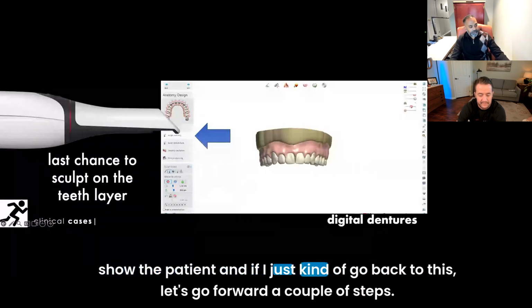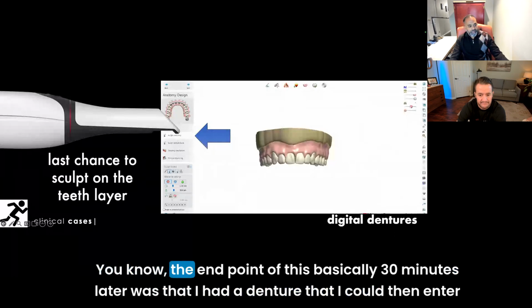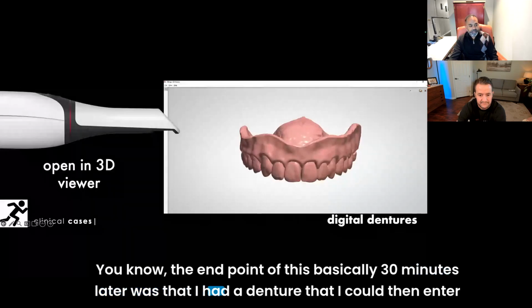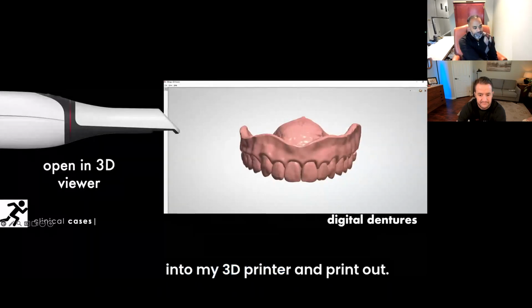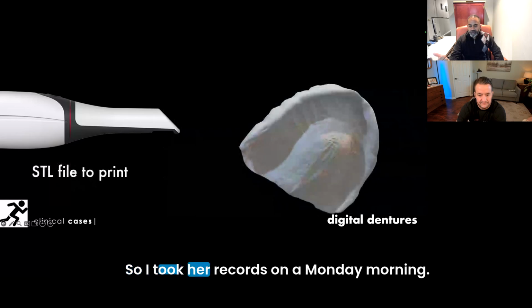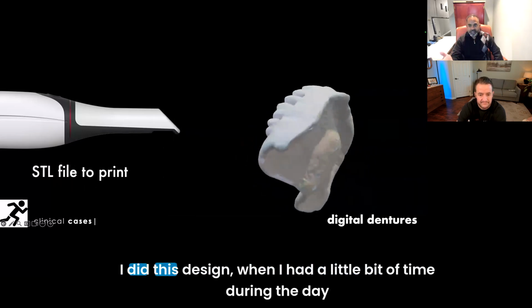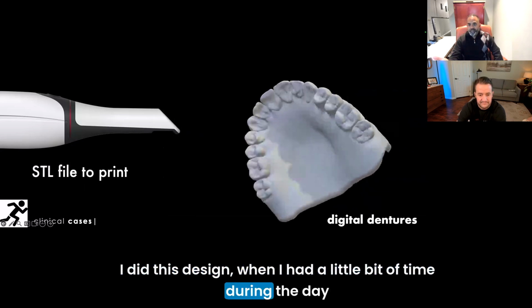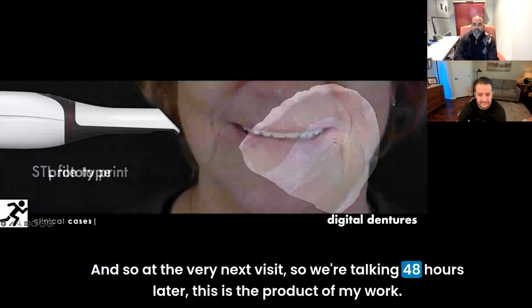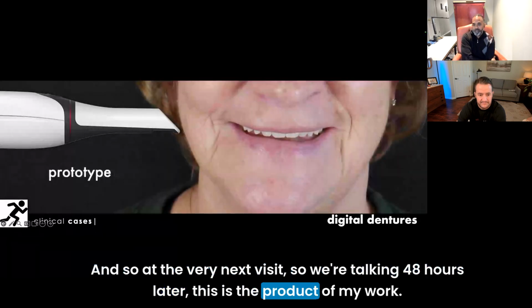If I just go back to this, let's go forward a couple of steps. The end point of this, basically 30 minutes later, was that I had a denture that I could then enter into my 3D printer and print out. And so this is the output of that. I took her records on a Monday morning. I did this design when I had a little bit of time during the day. And so at the very next visit, 48 hours later, this is the product of my work.